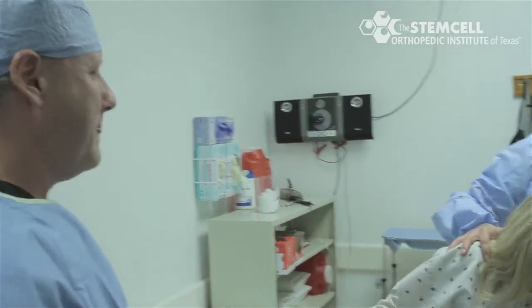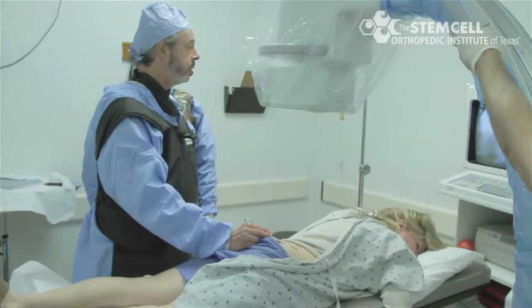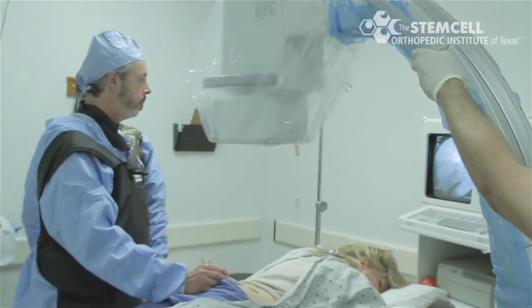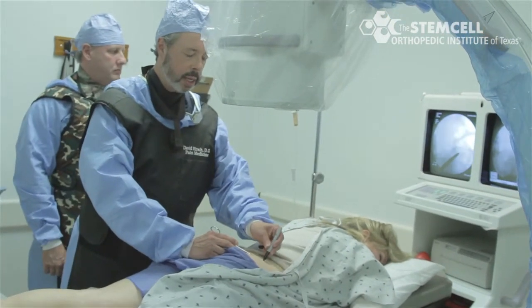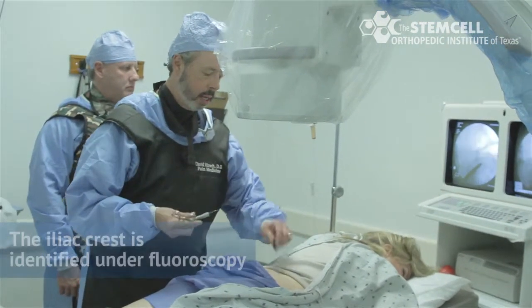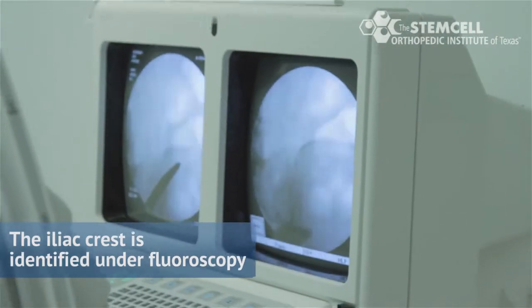After being sedated, she is laid face down on her stomach, exposing the area of the posterior iliac crest where we will be drawing our bone marrow aspirate. The area of the crest to draw the bone marrow aspirate is identified under fluoroscopy.